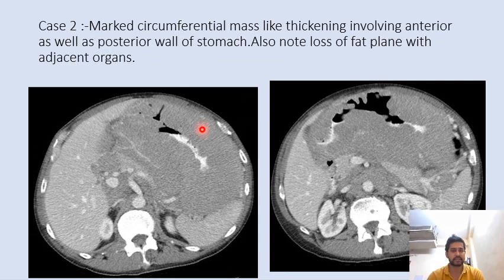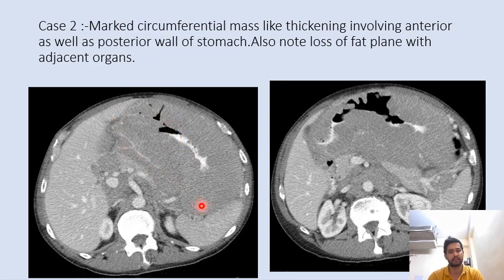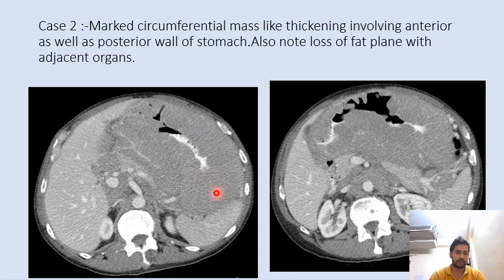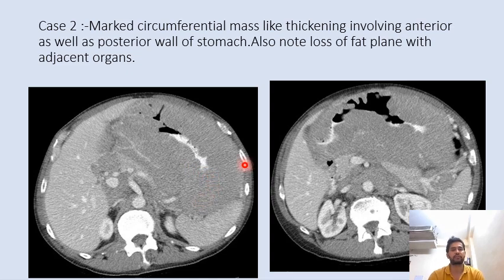In case two, this is the gastric lymphoma involving both the anterior and posterior wall, with marked circumferential thickening. We can still see contrast passing through the lumen, so again, obstruction is a rare feature in gastrointestinal lymphomas. We can also see loss of fat planes.